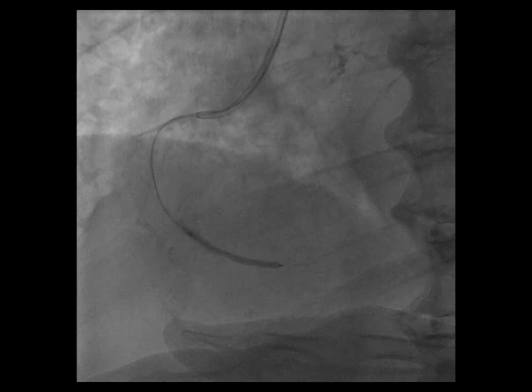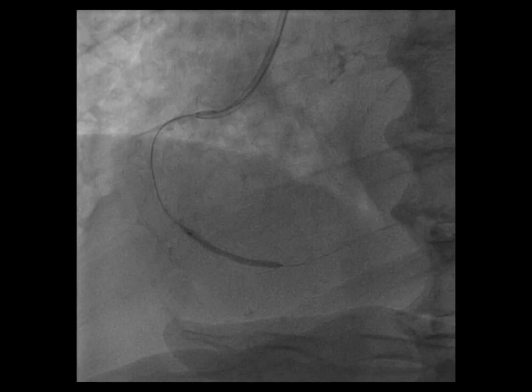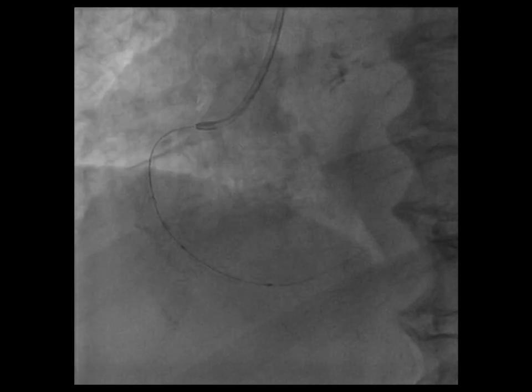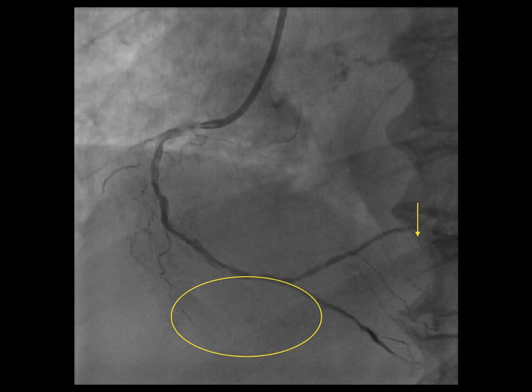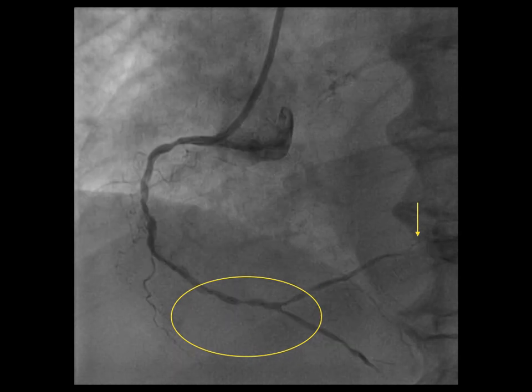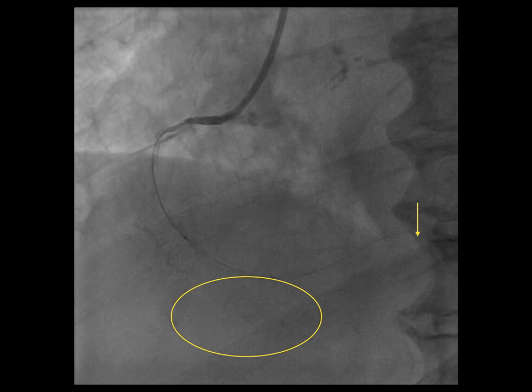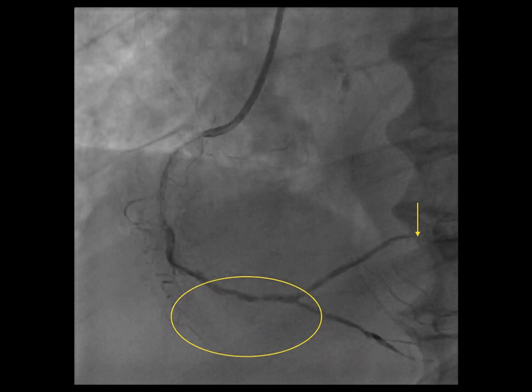We cannulated the right coronary from the start with a GR4 guiding catheter from the right radial approach because we suspected that the culprit would be the right coronary artery. We could cross the lesion with a run-through hypercoat wire, and we inflated a 2.0 x 25 mm semi-compliant balloon across the lesion. After balloon dilatation, there is significant residual stenosis and some dissection at the site of the occlusion, as well as some distal embolization in the posterolateral branch, but we still had TIMI-3 flow.